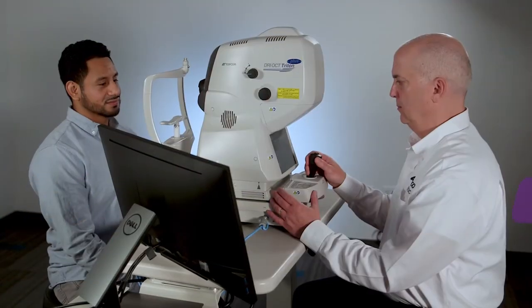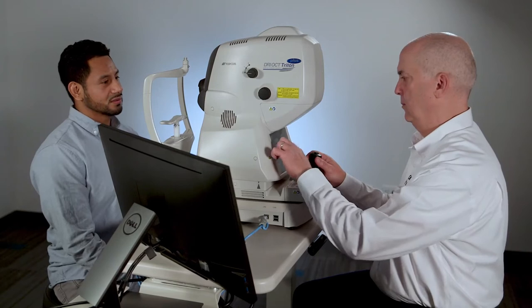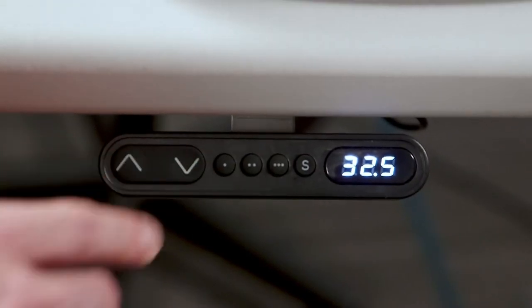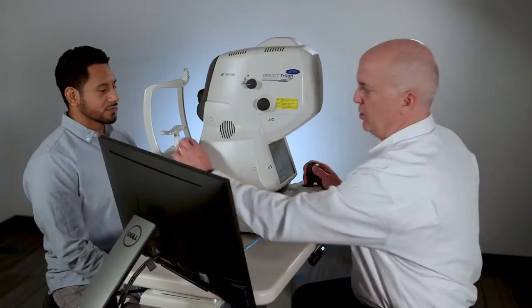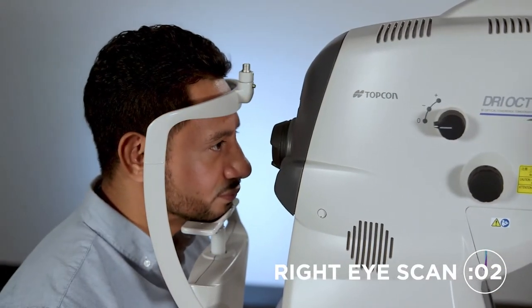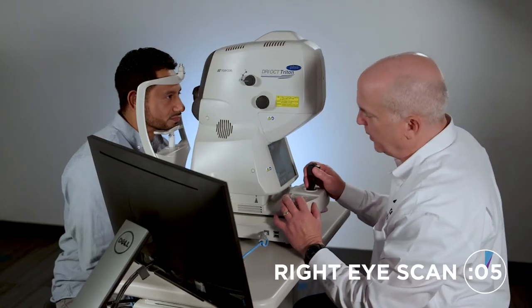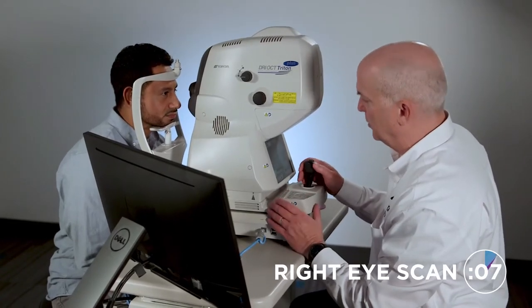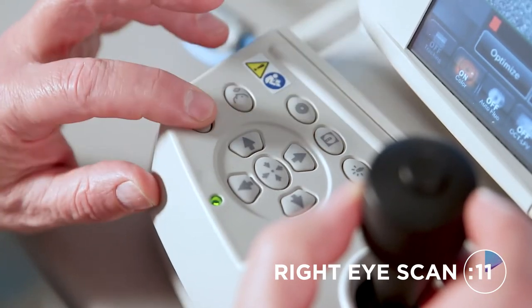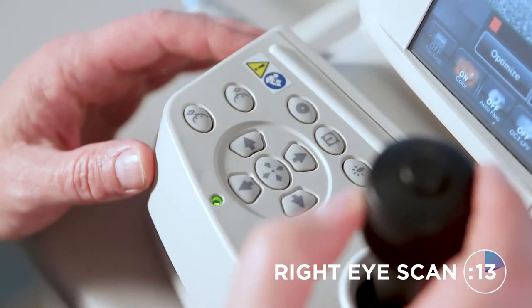Now that we have our scans selected and are ready to capture, we properly position the patient at the Triton. First, raise and lower the table as necessary. Place the patient's chin on the chin rest and the forehead touching the forehead rest. Adjust the chin rest height to align the eye to the headrest canthus marker line, using the up and down motorized chin rest buttons found next to the joystick on the Triton base.